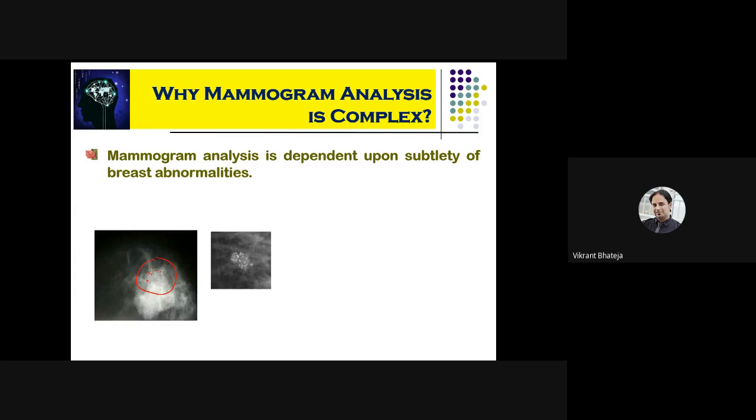These calcium dots are known as microcalcifications. Once these small dots are at a distance apart, they are scattered. Here you see that a kind of clustering of these dots has taken place. So this becomes a grown cluster of microcalcifications, and at later stages this cluster gets converted to a mass.